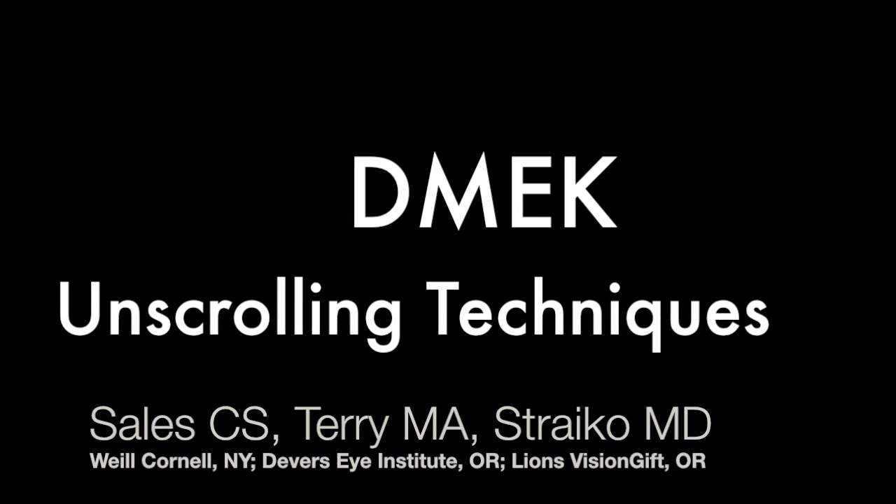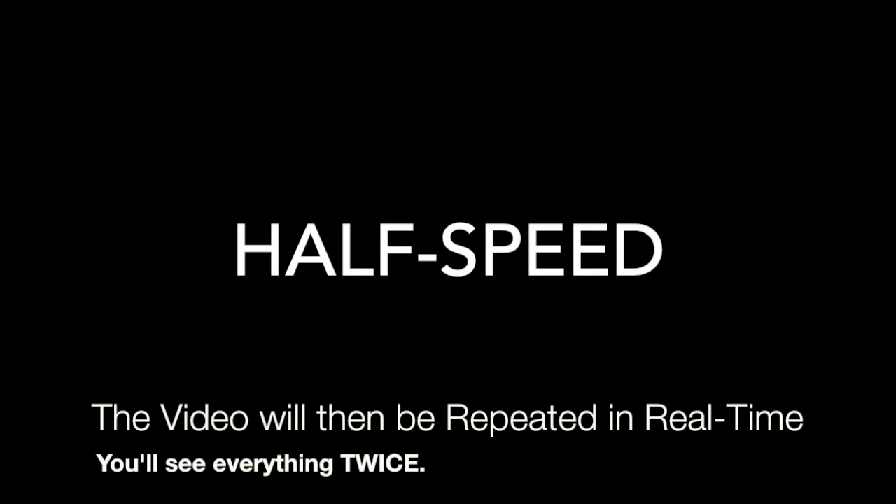The video is uncut and will be shown in slow motion at first and then it will be shown again in real time.